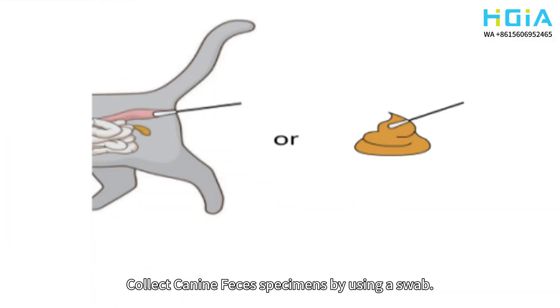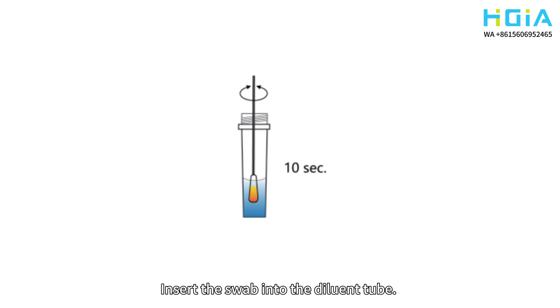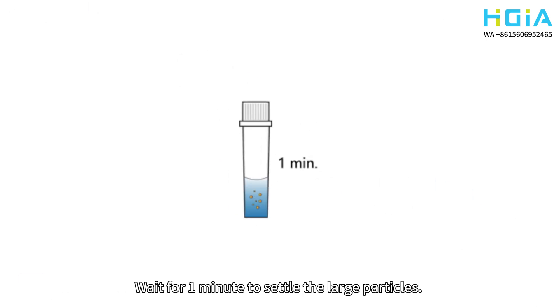Collect canine feces specimens by using a swab. The volume of feces required is shown in the picture. Insert the swab into the diluent tube and mix until the specimens have dissolved. Wait for a minute to settle the large particles.